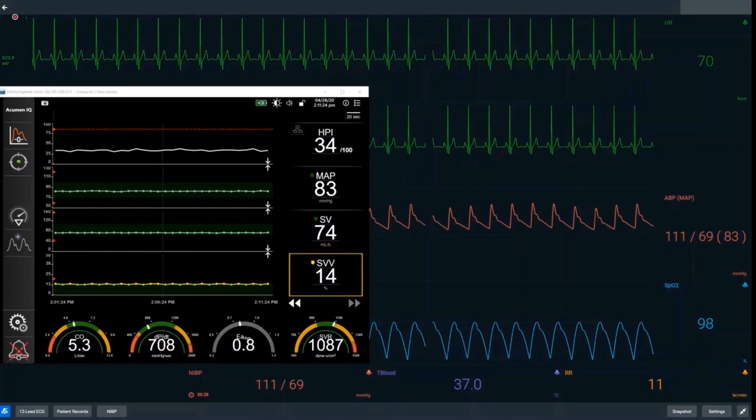We have our mean arterial pressure, stroke volume and stroke volume variation, which is a measure of preload responsiveness. The dials at the bottom of the monitor show cardiac output, dP/dT which is a surrogate for contractility, EADYN, and our systemic vascular resistance. The simulation is run at one and a half times speed in order to make the information succinct.